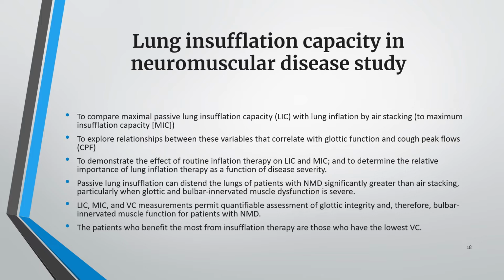So the point here is to show that lung insufflation capacity is a great tool. It's nice to do it if you have no other tool. You could do some air stacking, but if you have the ability to have some kind of resuscitator, which is not that difficult. I mean, I can imagine you could have a resuscitator at home and you stack your breaths that way via MIC, you get a much better result from it.